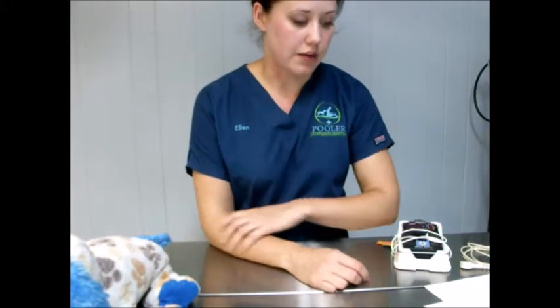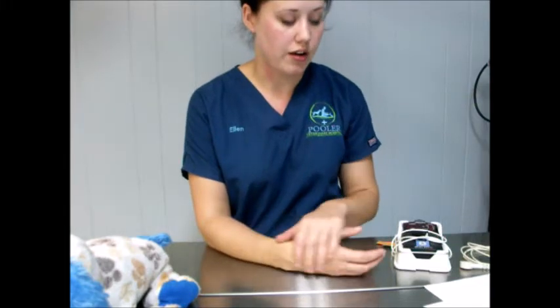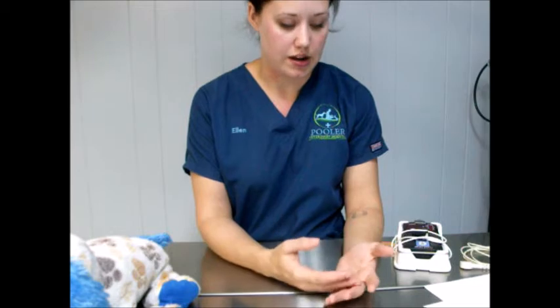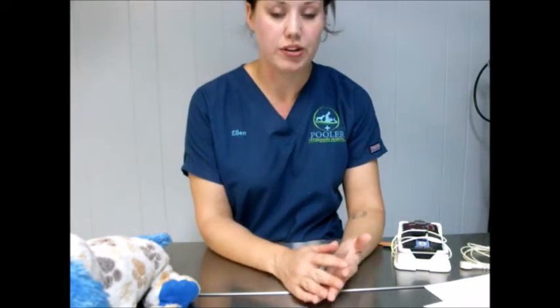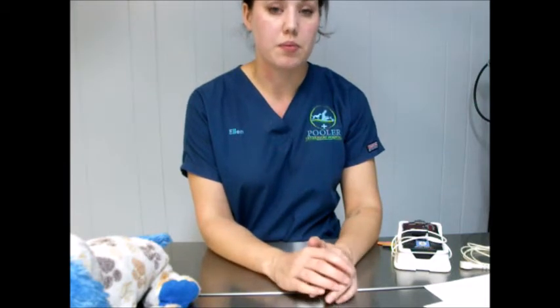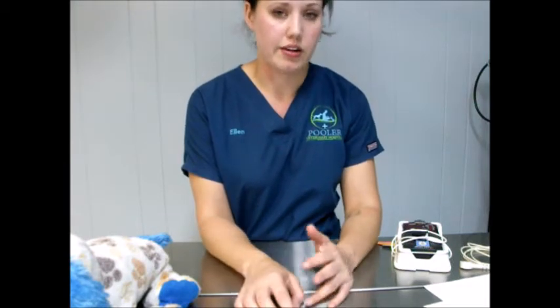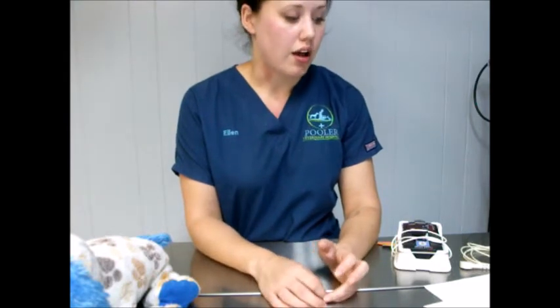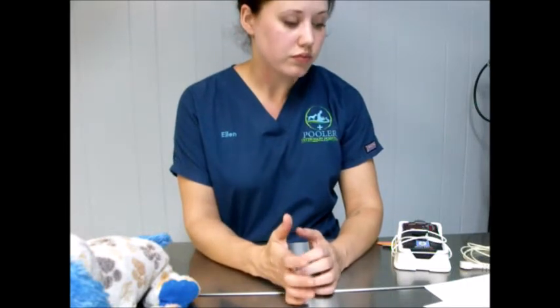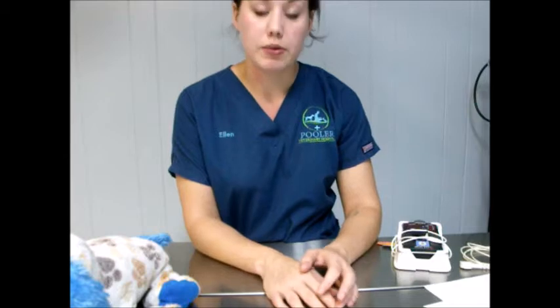In patients, the readings are going to be a systolic, diastolic, and a MAP, or the mean arterial pressure. The main one that we look at, because it's going to give us the best reading, is going to be that mean. You want that to stay above 60. In a normal anesthetized patient, it's between 60 to 150 usually. So you want that to stay at least above 60.